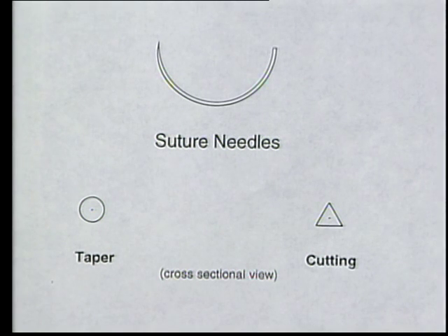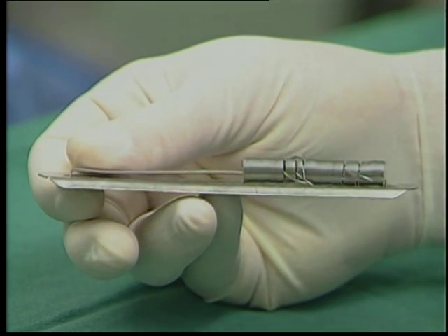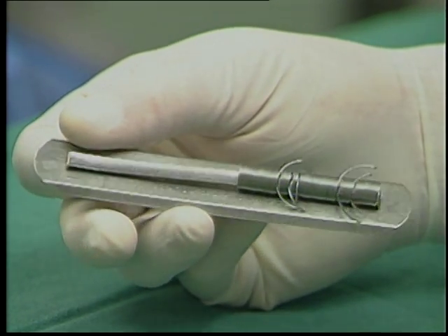The taper needle has no cutting edges, and thus passes through delicate tissues with less tissue damage. Both of these needles will be used by the veterinary surgeon at various times depending on the tissue being sutured, and should be regularly replaced as needed. Special clips or gauze sponges are often used to contain these sharp needles within the surgery pack.